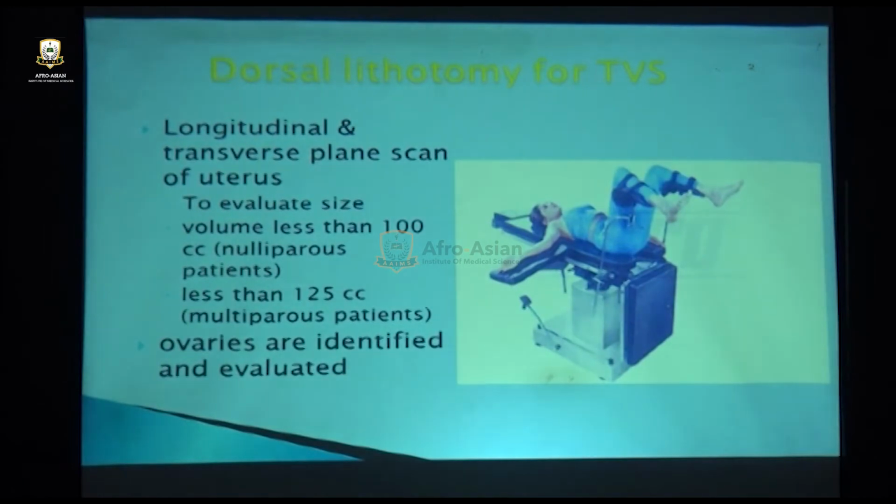And this is the position which is called lithotomy position. But remember, not always these stretchers or stools are available. So what you can do is, there are two methods. बिस्तर पे लेटा के patient को put pillows underneath the buttocks. That will elevate it a little bit. The legs can be adjusted, and this procedure can be done.